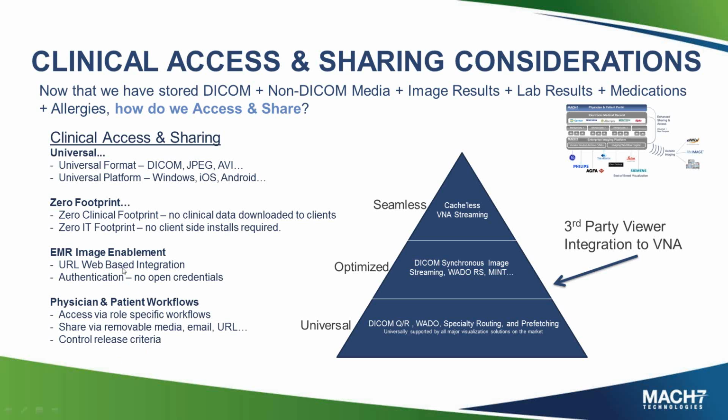Along with clinical access too, does it have a URL-based integration? Can it be launched from an EMR? And when it gets launched from an EMR or a portal, does it have proper authentication and authorization mechanisms to authenticate the user? Does it use encrypted URLs or a direct API approach? Those are the types of things you want to look at.